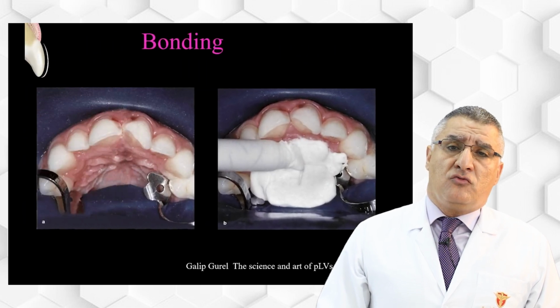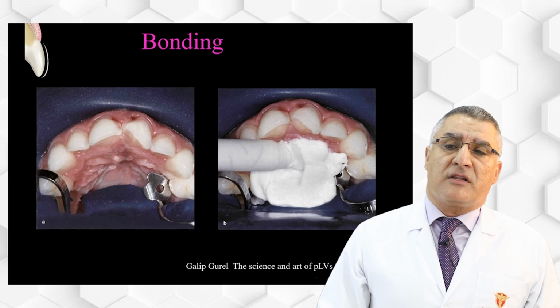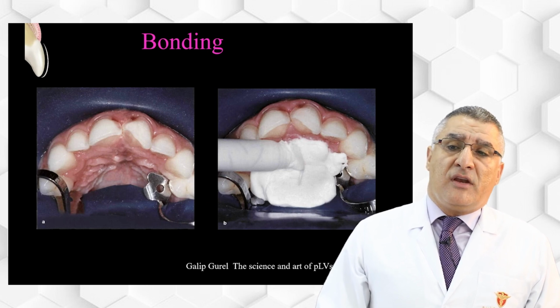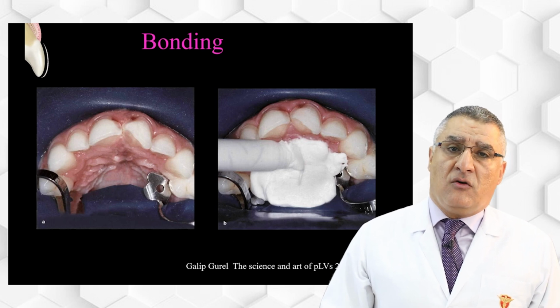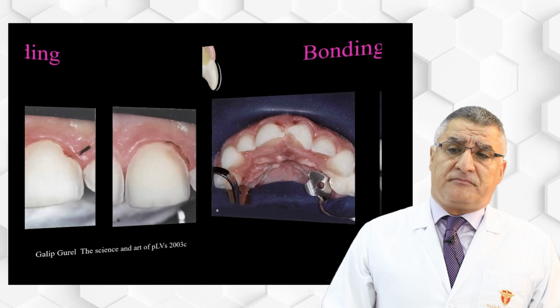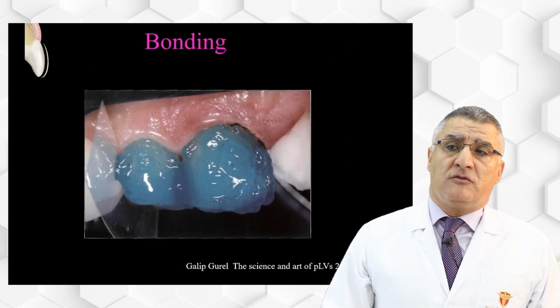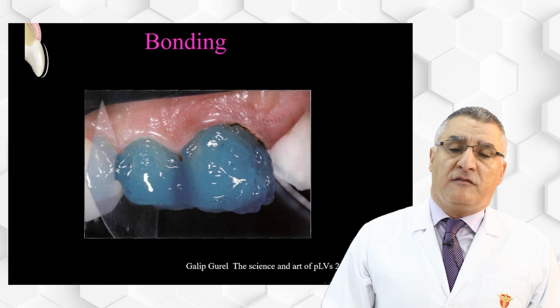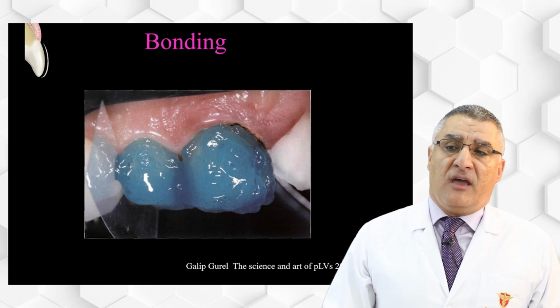It should be left for 1 minute to dry, and make gentle drying after application. Then after you do this treatment for the ceramic, you have to go to the tooth, put your rubber dam and make good isolation. Then you start to etch the tooth with the phosphoric acid for the enamel 30 seconds, or any exposed dentin only for 15 seconds. Then here we have to do 2 by 2. During etching or bonding, you have to do 2 by 2.